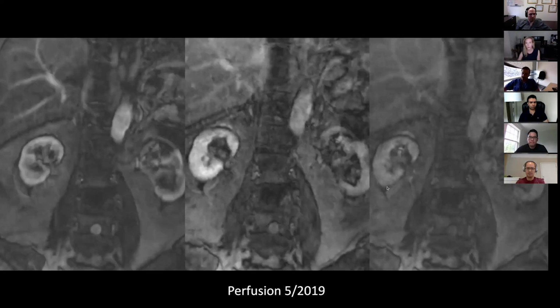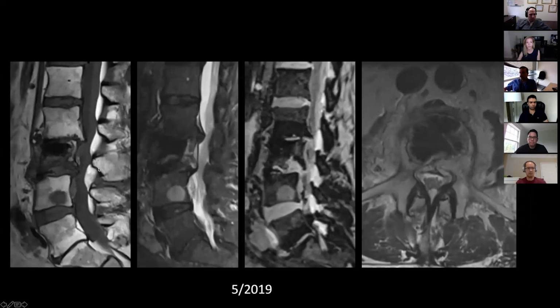And you can see the treated level is showing some enhancement along the inferior aspect. The patient has developed a new metastasis in the L4. But this is what I wanted you to get an idea about. So this is the ablation zone after we did our ablation, and of course there is cement inside it. And even the soft tissue component has significantly reduced in size from where it was before.